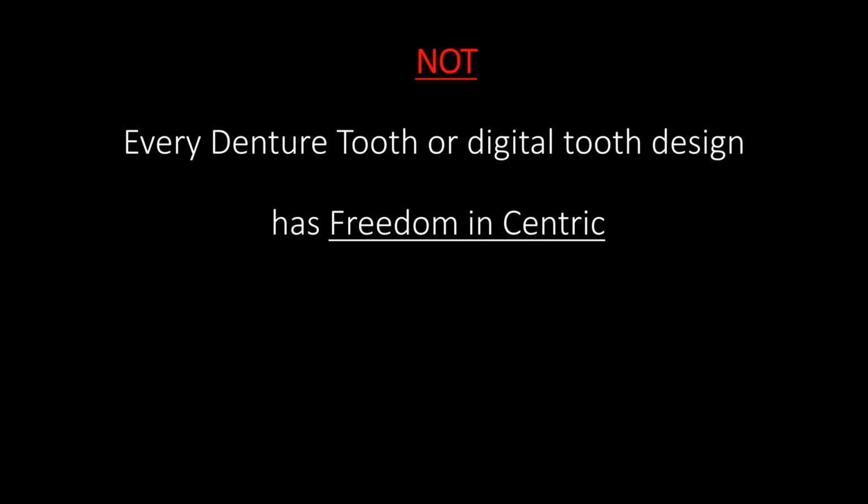So I've gone on a journey to research this. VITA has it, but only in their lingoform teeth, MFT posterior teeth, and Physiodens posterior teeth. All of the other tooth brands within the VITA line do not have freedom in Centric. When you hold them together, there's a little bit of wiggle in some, but in other lines there's no wiggle.